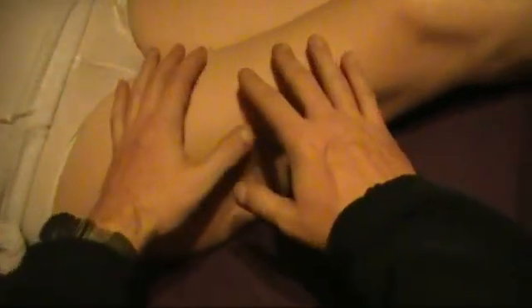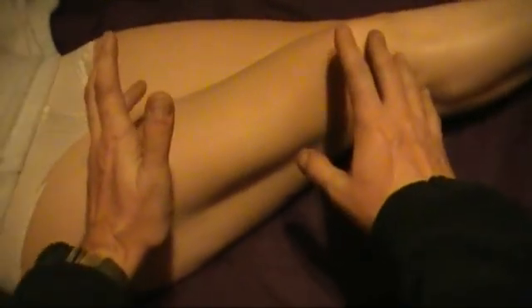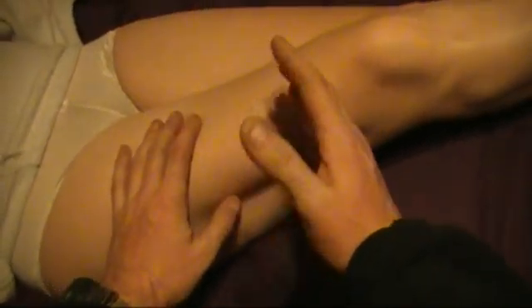The first thing we're going to teach today is the proper use of a tourniquet. Now, in civilian EMS, which I did prior to joining the military, the tourniquet is a big frowned-on thing because it was thought to inflict neurovascular damage, gangrene, stuff like that. So it was shied away from. Even early in my military career, the stigma made the tourniquet a really touchy subject, when in reality, tourniquets are not that damaging.